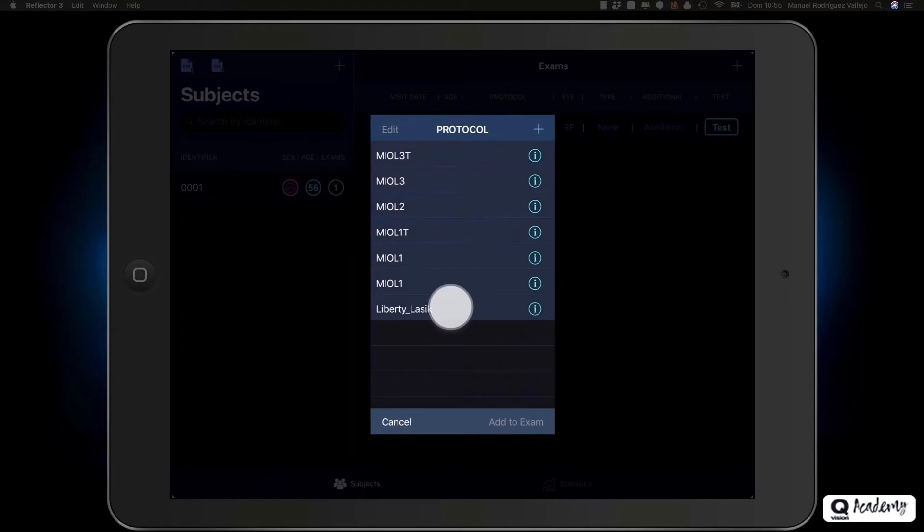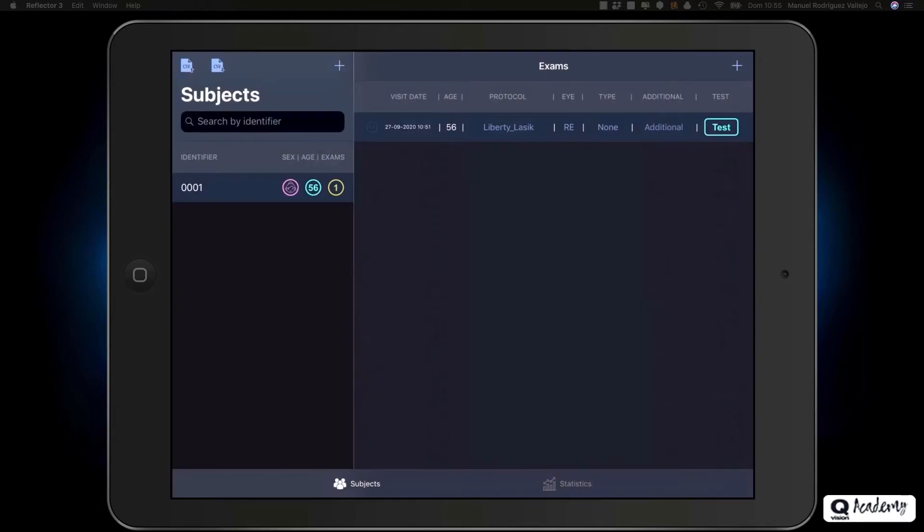Select the protocol and add it to the exam by clicking on add to exam. Before starting the exam, we will need to select the exam type and fill in the additional information associated with the exam.